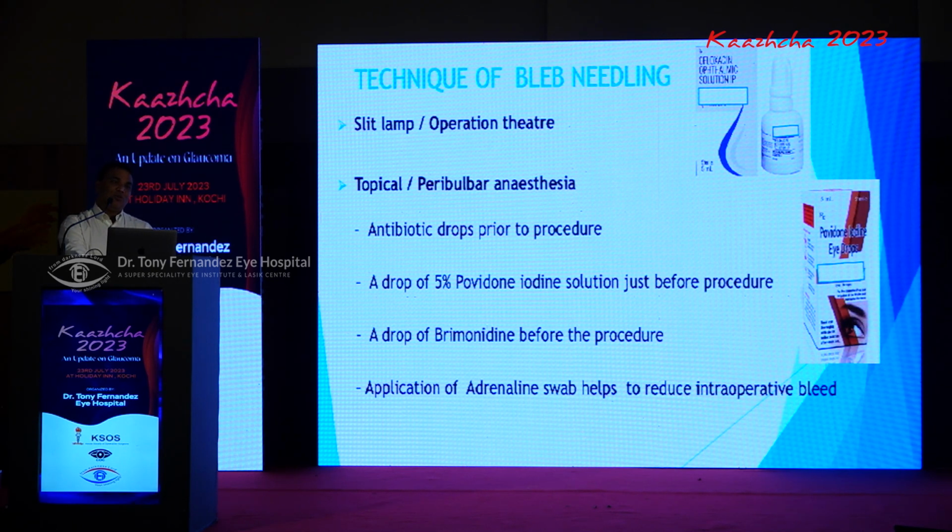I strictly say go for the peribulbar anesthesia, because again, making one more opening into the conjunctiva, I'm not happy making my conjunctiva to be disturbed, especially when my bleb has failed. And really, if you are a master, then you can do it in topical anesthesia by supplementing with subconjunctival lignocaine. And all the aseptic precautions have to be taken.